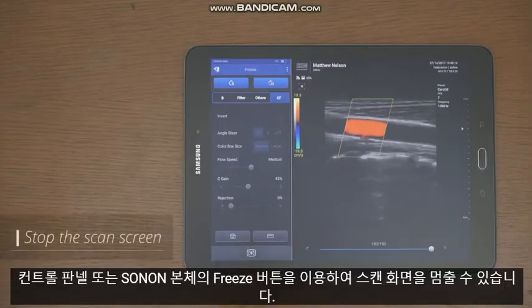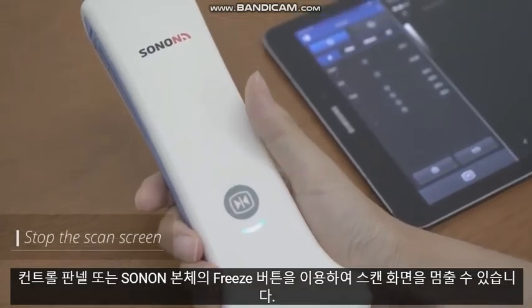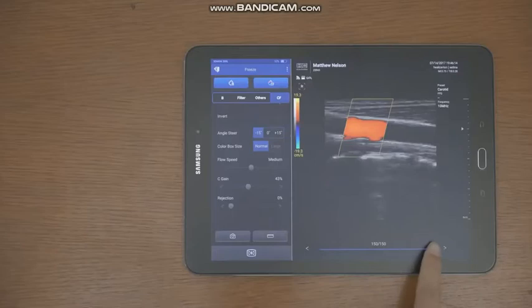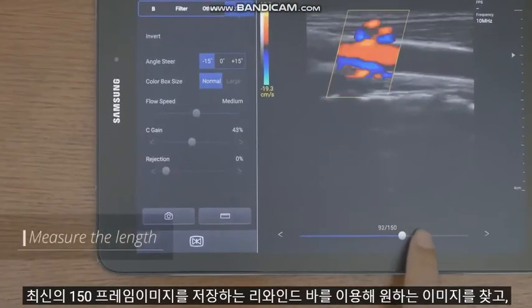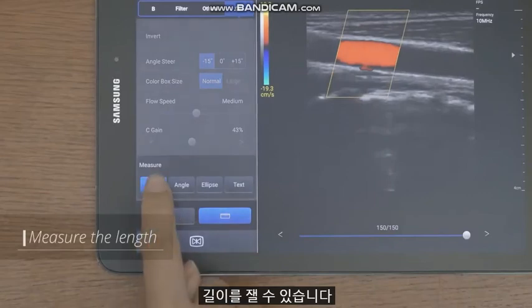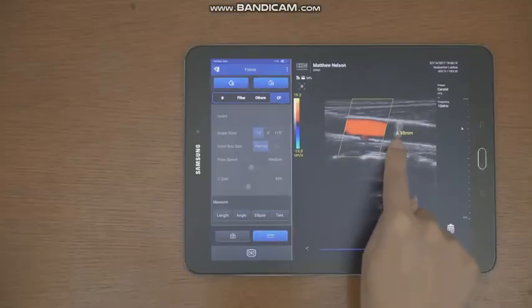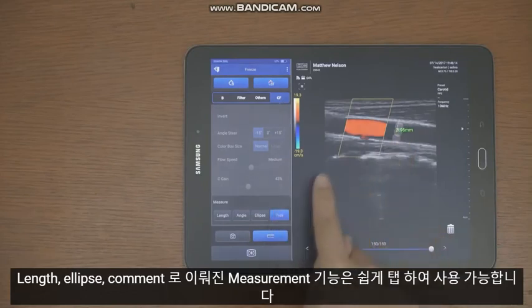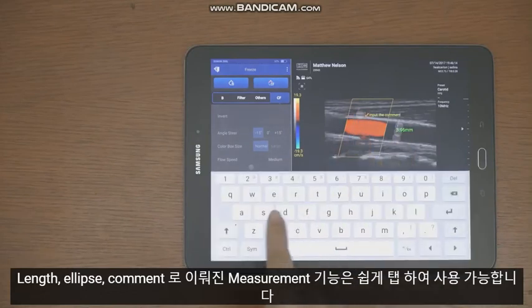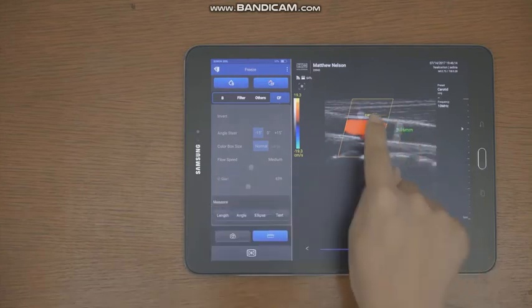You can stop the scan screen using the freeze button in the app or the button on the front of the device. You can find the desired image and measure the length with the rewind bar, which stores the latest 150 frame images. Measurement functions such as length, ellipse, and text can be easily used. For the convex probe, fetal biometry is added to calculate BPD and EFW.